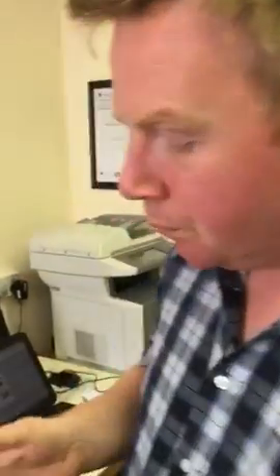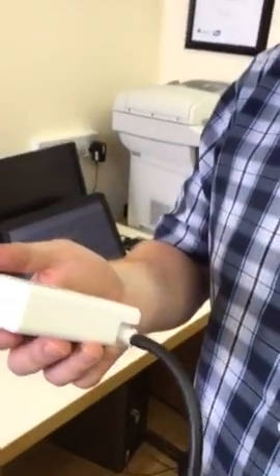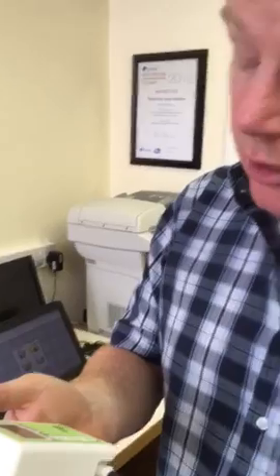Okay. We'll just wait for it to run. I won't give you the readings because that's not fair. It's personal healthcare information.